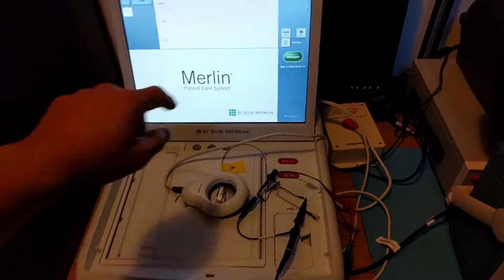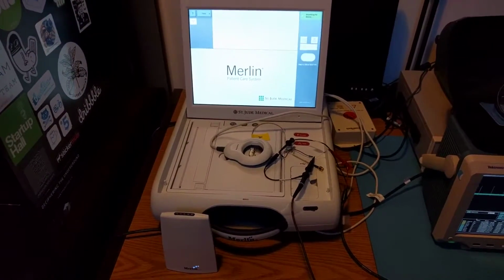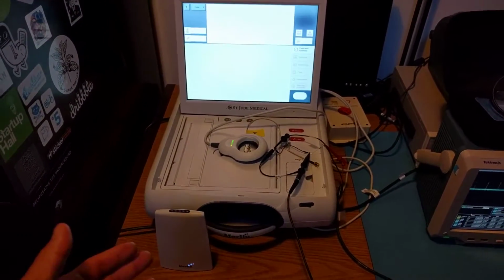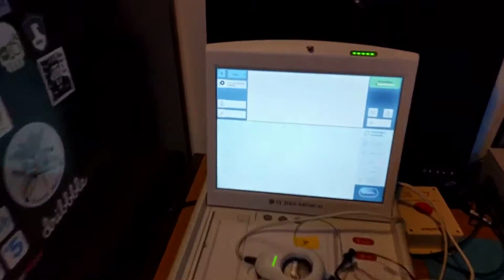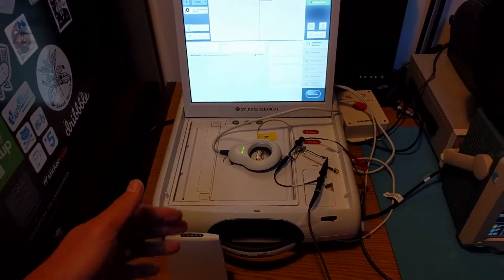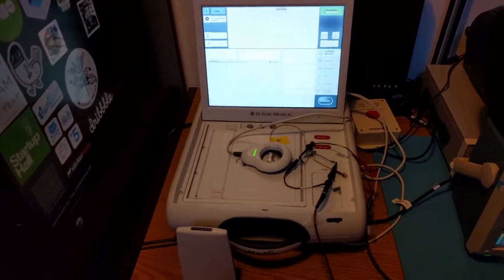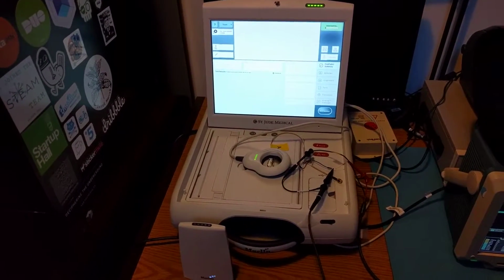Now let's try to interrogate the device. Prior to this session, we have run a long RF session with the pacemaker, so now only wand telemetry is available. So there's no communication over RF, although we were communicating over RF to the programmer, which has exhausted its energy budget for that particular interface.